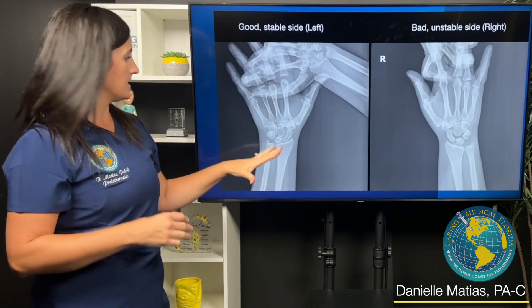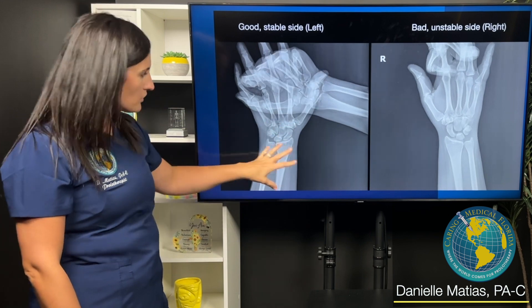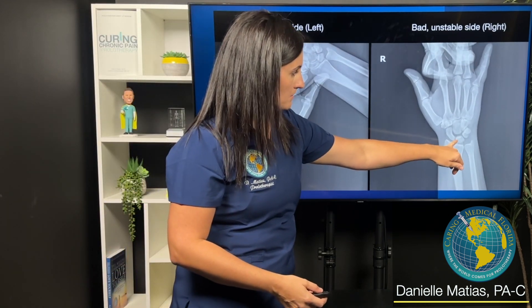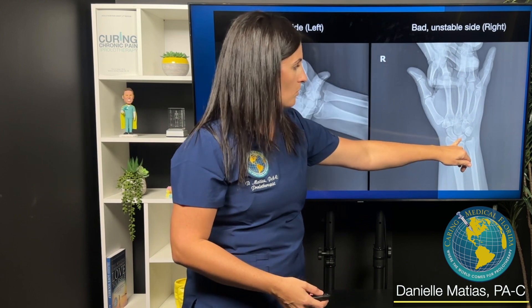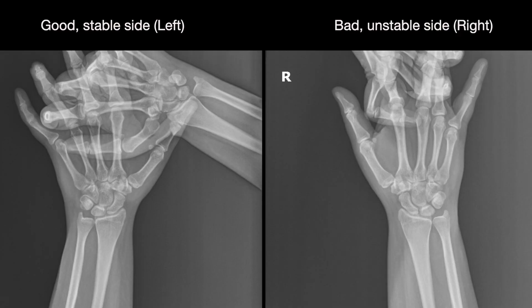That is how we're diagnosing whether these joints are moving more than they should. Here on the patient's good side — the stable side — you can see that when force is applied, everything really stays in place. If you compare that to the unstable side, you can see how much more separation you're getting between those joints as compared to the stable side.